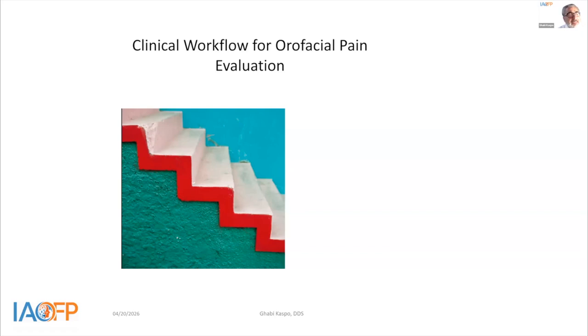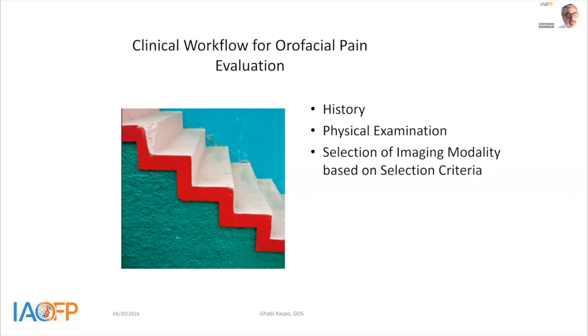Now, in our clinics, how do we follow our patients? We take history, most of the time a lengthy history. We perform a clinical examination, and we have to think about what kind of imaging we need, if we need it. We don't have to expose the patient to any radiation if there is no need. Sometimes we need to consider other testing, blood work, ultrasounds, whatever.